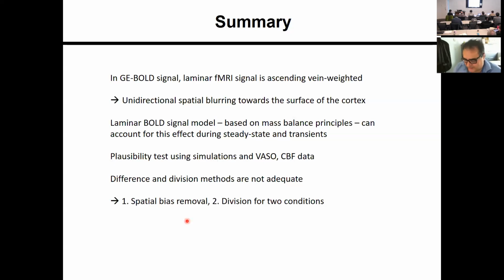So I would not do that. But one thing which is so interesting is we have the issue of physiological noise, which we didn't investigate, how it would affect this kind of thing. So I think there are still things to further investigate beyond what we did. But yes, you're right. If you have unreliable data in lower layers, then you might create more problems than you solve.